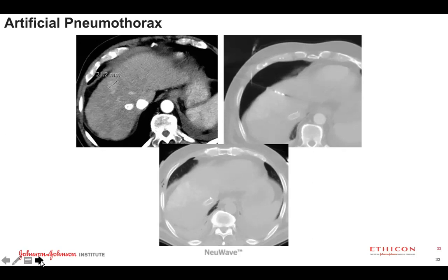You don't have to drop the lung all the way, but you give about 500 cc's of air and the lower lobe basically just collapses out of the way, and you're able to position your probe directly into the lesion, do your ablation. When you're done, through that same micropuncture sheath that's in there, you can aspirate all the air out until the lung has fully expanded, and you can even use positive pressure if you want with your anesthesia colleagues to help reinflate that lung.